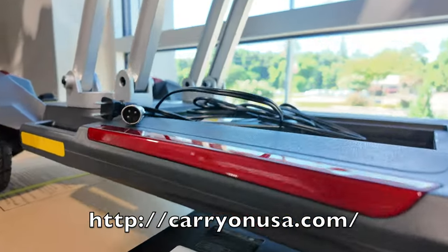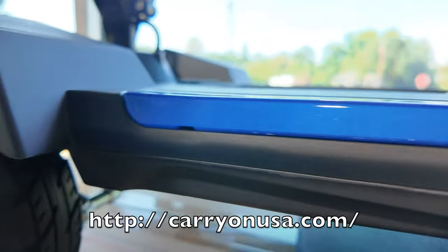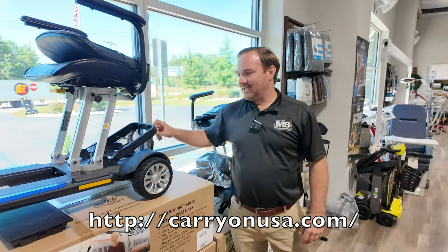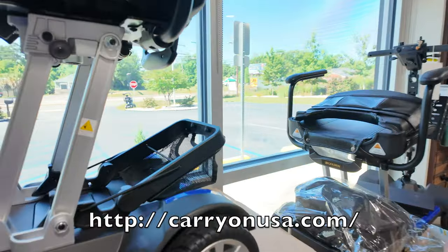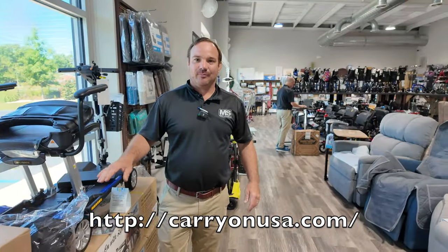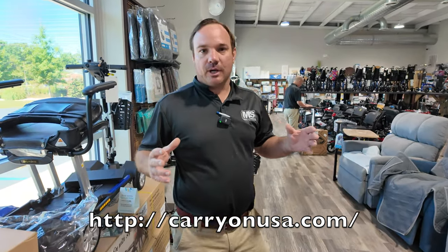Two options with batteries: the long-range 15 amp hour or the new long-range TSA. You're going to get that kickstand. You're going to get a bag for the back, or you can get the travel bag if you're getting the TSA package if you're flying, but we do different colors.